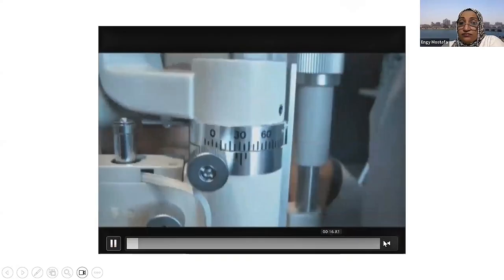So if I want to make things easier, I would go like this in my head. I would start with diffuse, then I would decrease it a little bit. This is parallelepiped, and then I'll go with the optic section, and then I will decrease the beam so much to get the conical beam, and then I would do the indirect illumination along with the direct, because they are both done in the same maneuver.